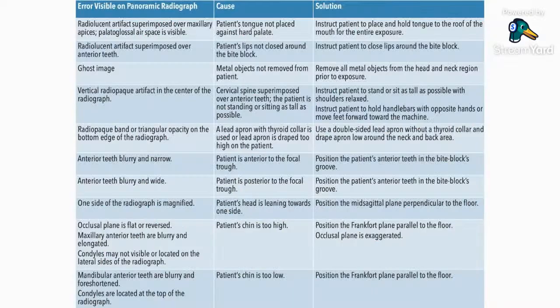Okay. All right. Once again, I'm not going to go through the whole table. The purpose of putting such a detailed table is so that you guys can read and understand, because I have told you the whole concept of the positioning. And hopefully, when you read through this, you will understand why such a position. If you do not position the patient in the correct position, it will result in a not good image, and you may want to take the image again. That means you will be exposing the patient to the radiation again. Okay. So as an ethical practitioner, you will want to avoid that at all cost.